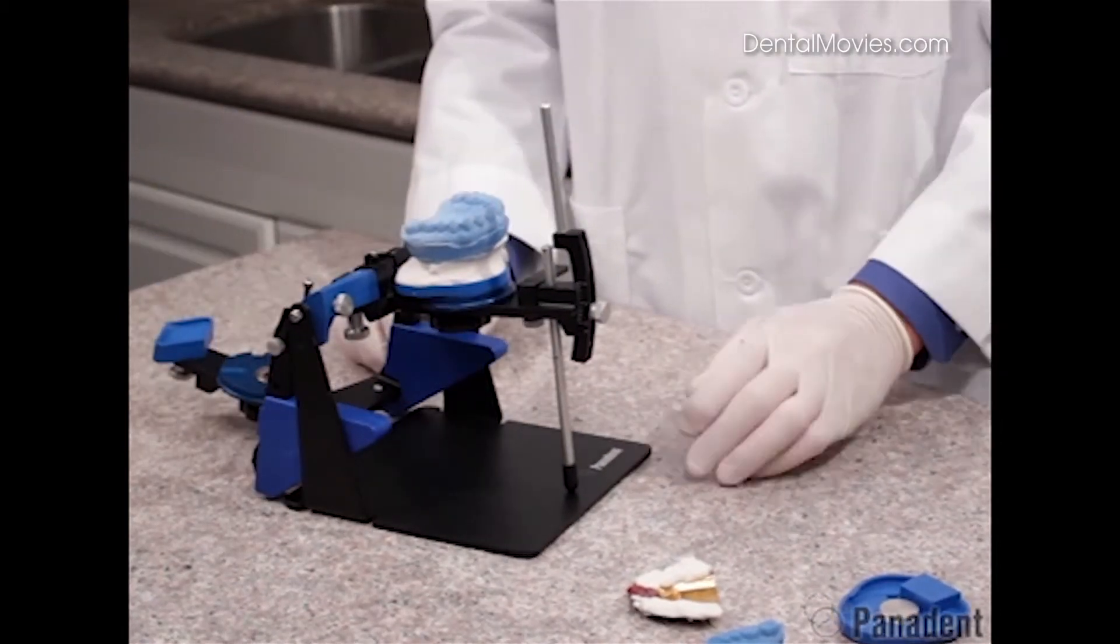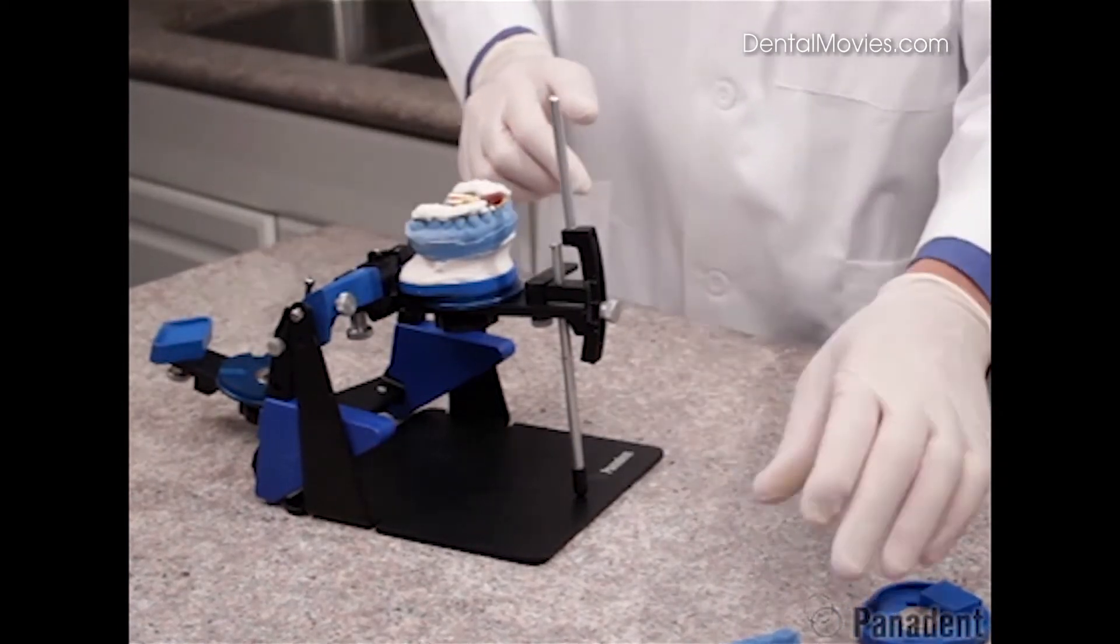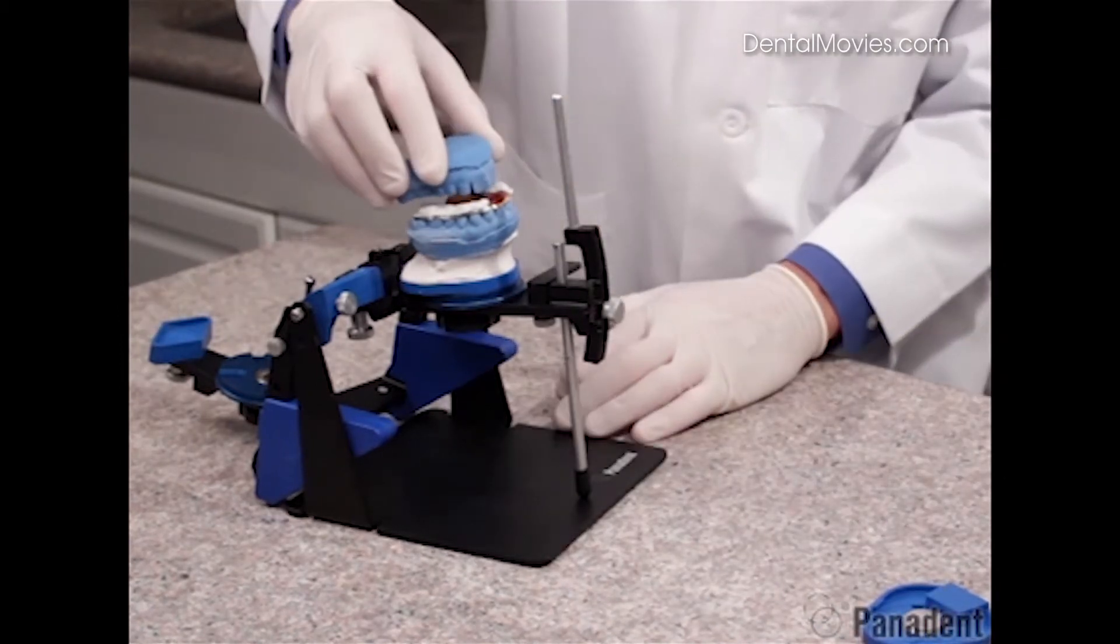And then rotate the lower frame back in preparation for adding the centric relation record to our maxillary cast. Then we can add our mandibular cast into the interocclusal record.